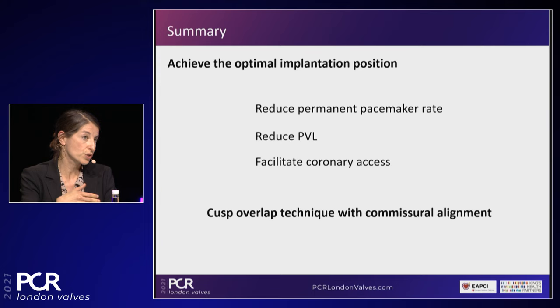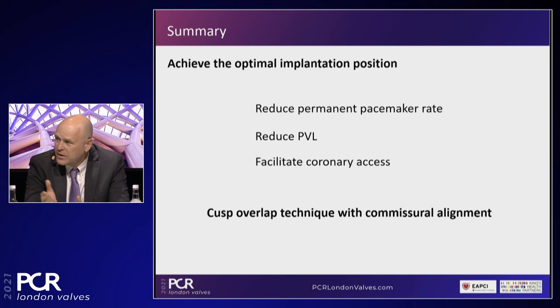And then, of course, you have to counterbalance the risks you are taking, because you have to retract the valve. You have to go further back to a rotation when you go forward again. In my experience, you are able to achieve a perfect rotation in 90%, but in 10% you are just not able to. And I think that we should refrain from pulling and going back again. The risk of scraping the arch and stroke is too much.